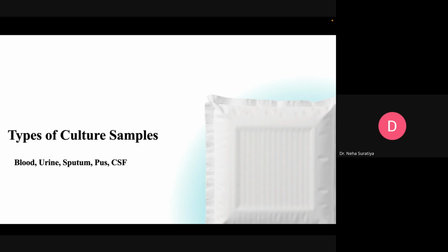So each culture has different interpretation rules. One rule does not fit all, but we will be more focused towards the blood and the urine for this module, because it is quite common. But please understand that every culture has a different interpretation, and it gives you a different idea. It is not all the same. So based on the situation, based on the diagnosis, the sample collection is further chosen.